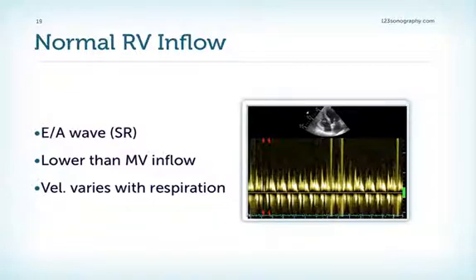Now, moving from morphology to physiology and the normal RV inflow — the normal flow across the tricuspid valve looks very similar to the mitral valve signal. In sinus rhythm we have an E wave and an A wave. However, the flow velocities are lower because the tricuspid valve is larger. In contrast to the mitral valve, the velocity varies much more strongly with respiration.